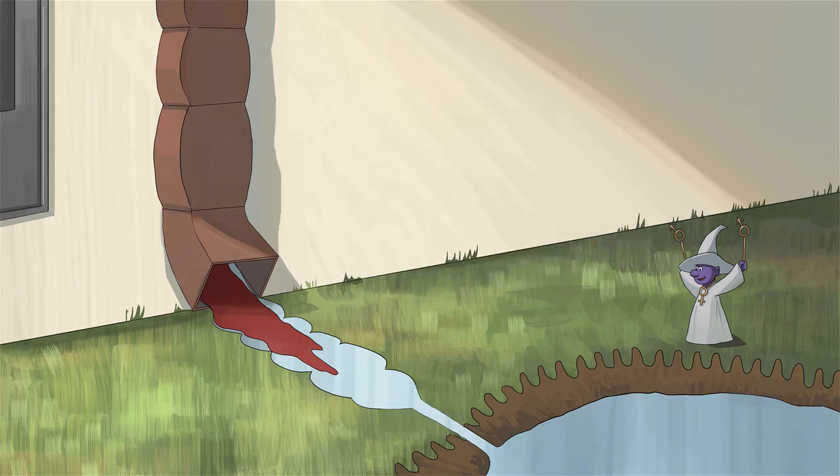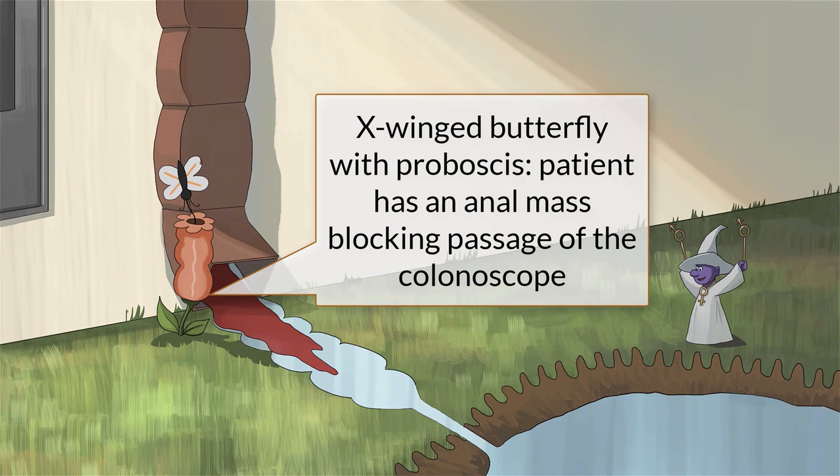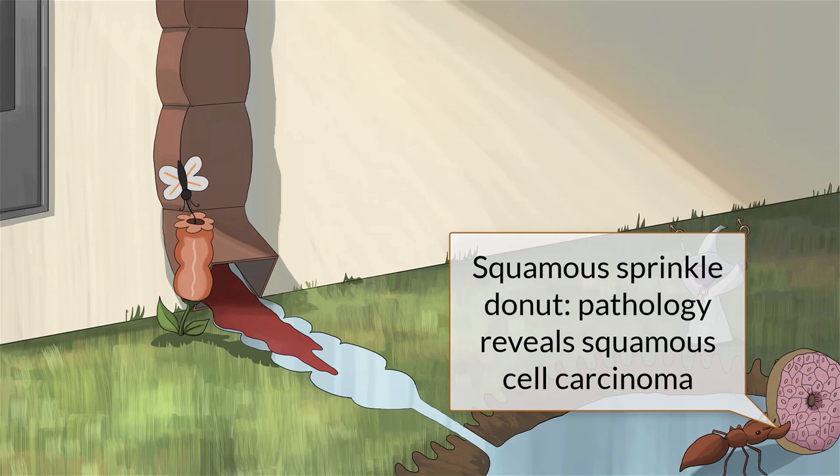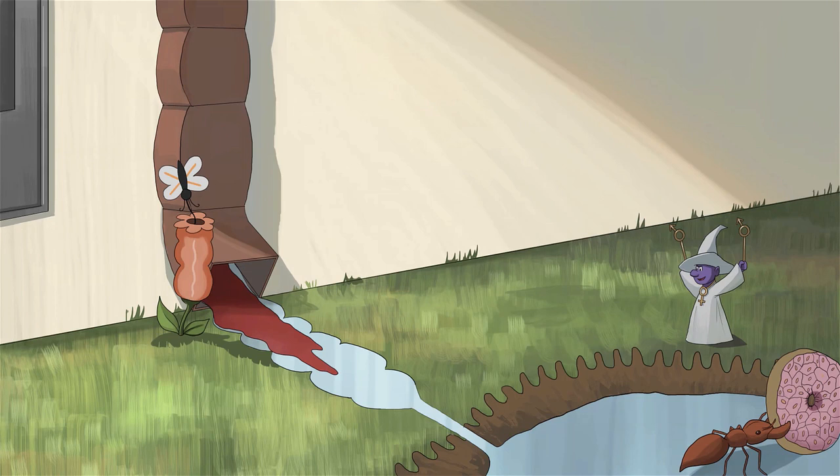You get all set and start to intubate the rectum. But your skilled hands have difficulty. It seems there's something blocking the scope. You take a look and there's a mass right between the rectum and the anus. You biopsy it, then call your pal at the pathology office for a quick read. He gives you an unheard of turnaround time of about 10 minutes. He says that it's malignant squamous cell carcinoma.